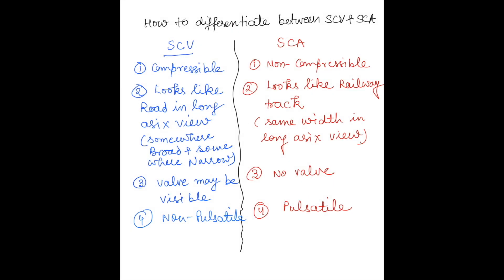In the long-axis view, you can differentiate between the subclavian vein and subclavian artery as follows: the subclavian vein is compressible while the subclavian artery is non-compressible. The subclavian vein looks like a road — broad in some places and narrow in others — but the subclavian artery looks like a railway track, with the same width all the way through. A valve may be visible in the subclavian vein but there is no valve in the subclavian artery. There is no pulsation in the subclavian vein, whereas the subclavian artery is always pulsatile.